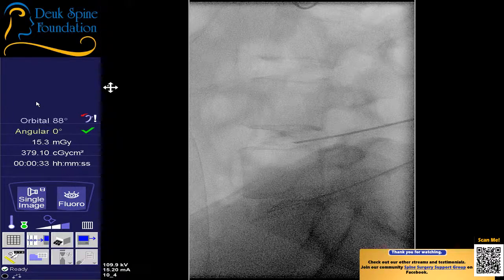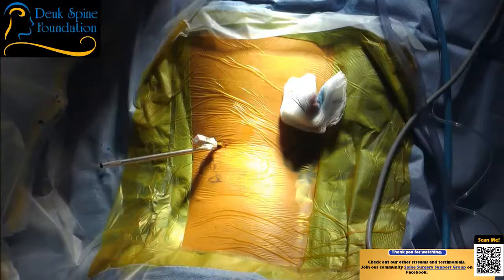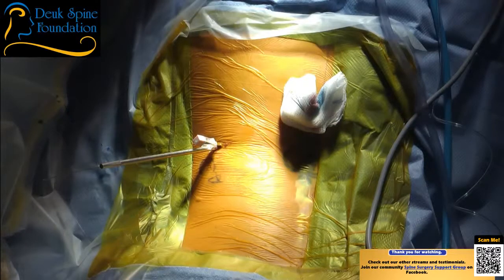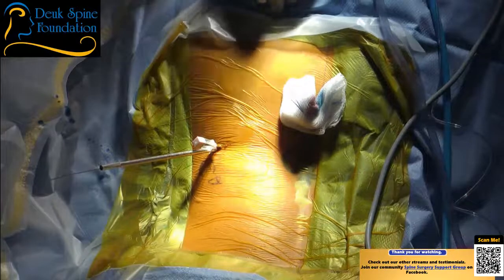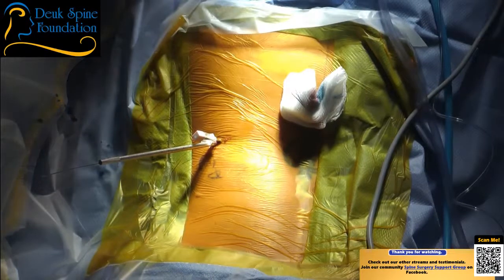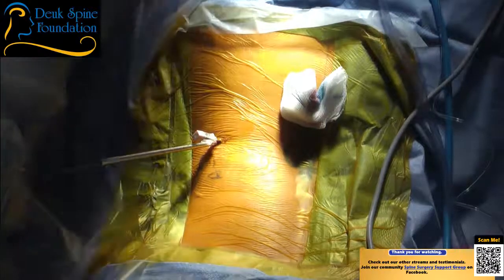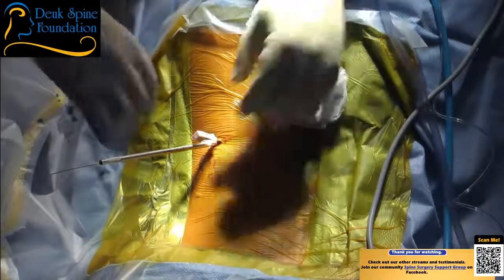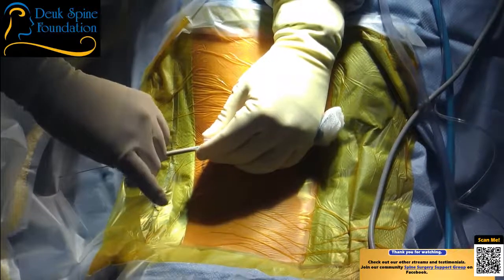Let's drop the table just about 1/2 inch, please. No, down. Good. Let's take a look at that. All right. Maybe bring it up 1/4 inch. Good. That should be perfect. Yeah, that's good. I like it. So let me know when you're ready, and we'll get started. I want her to be nice and comfortable.